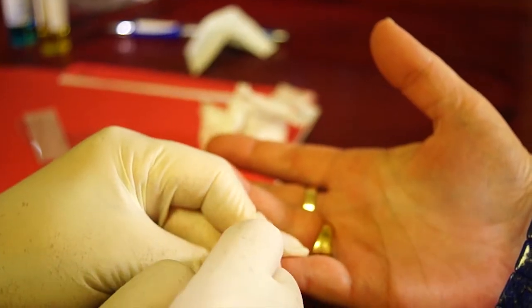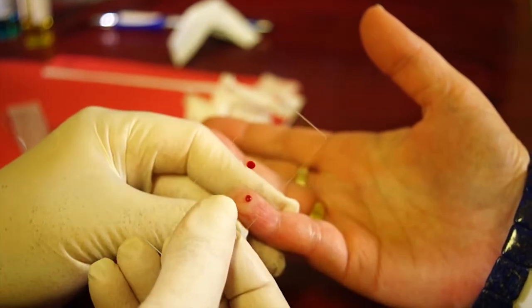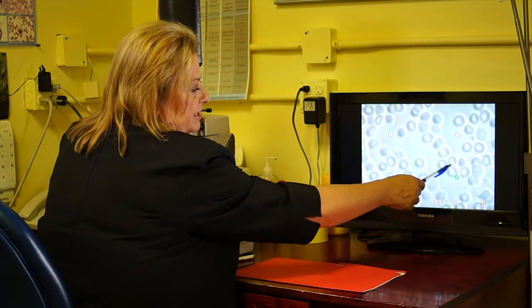Then we take a second droplet, and this will be our live cell. Just gather it without touching the finger, and then we put a cover slip over it so that the blood can't leave the slide. So this is the live cell, and you can see that the cells are still moving.